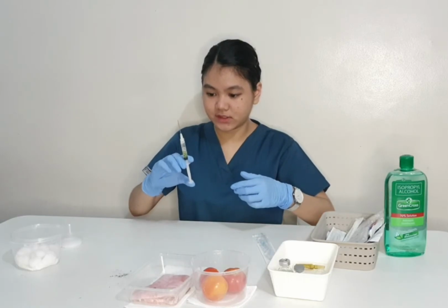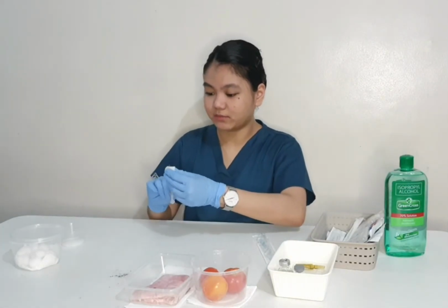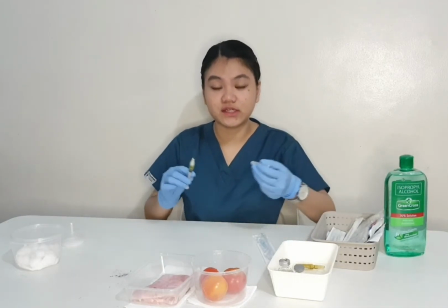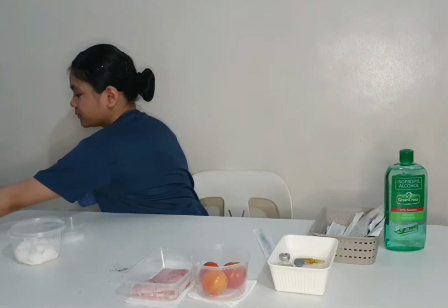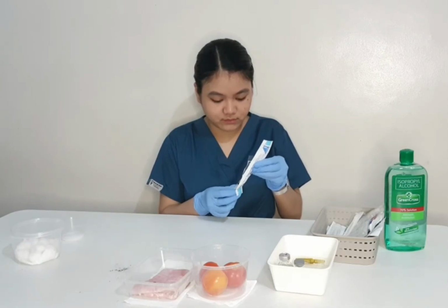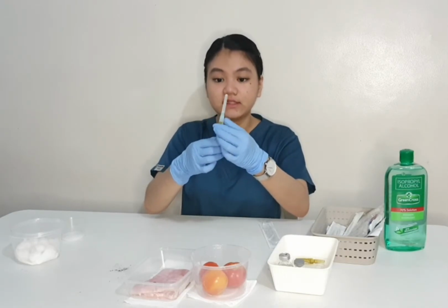Then let's remove the excess air. Let's wipe it with a cotton swab. After that, we will now be changing the needle to a 23 gauge needle, and then throw the old one in the sharps disposable bin. Next, let's insert the 23 gauge needle and just twist it. There you go. You now have the ampule medication in the 3cc syringe with a 23 gauge needle.